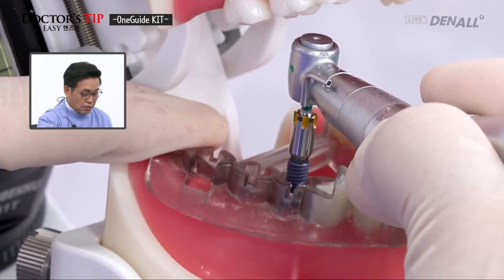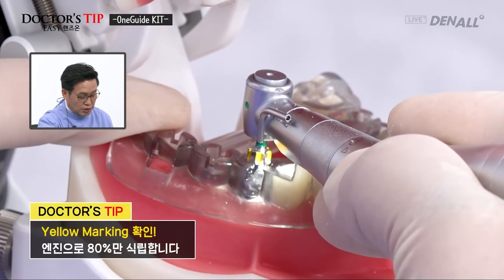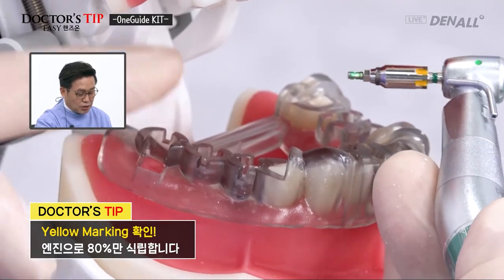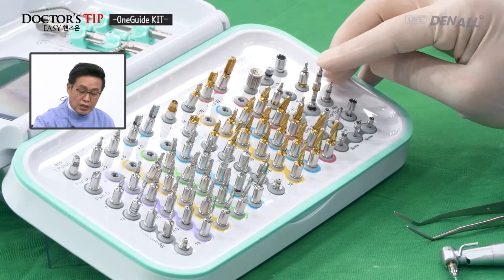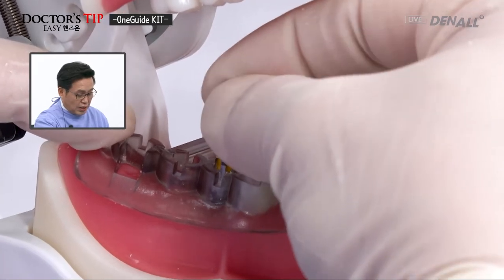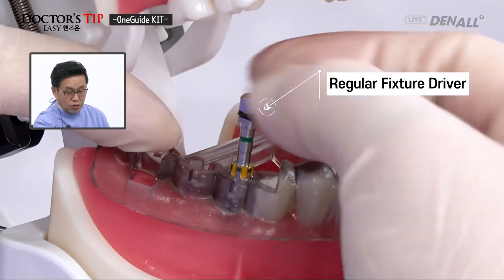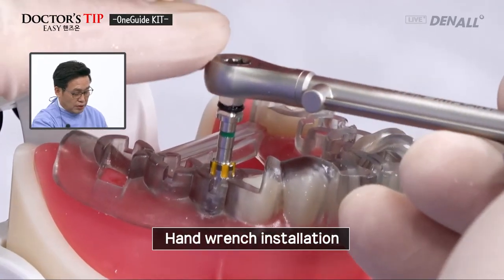Now, you put the fixture in its place using the engine. So you go in 80%, up to the point where there's a yellow marking. You do 80% with the engine, and after that, the fixture driver, in other words, the hand wrench, is going to be used. Because the fixture is inside the bone, you don't know whether it's in the accurate position. You check whether it has been well adapted, and you're going to use the hand wrench to connect it.